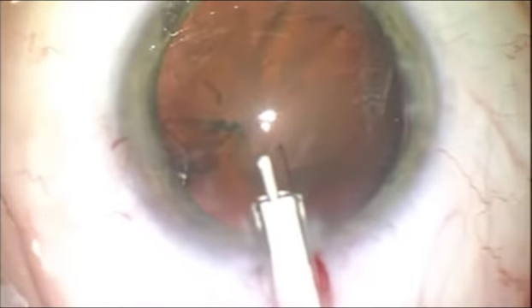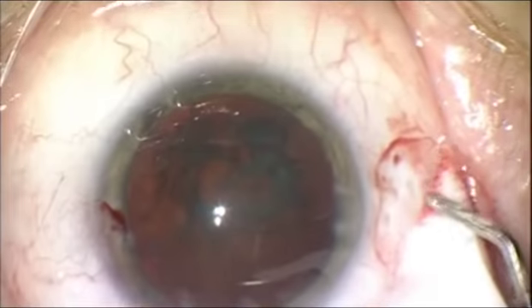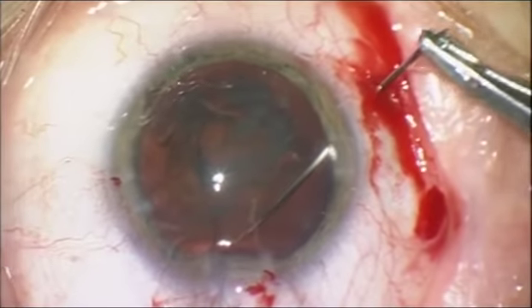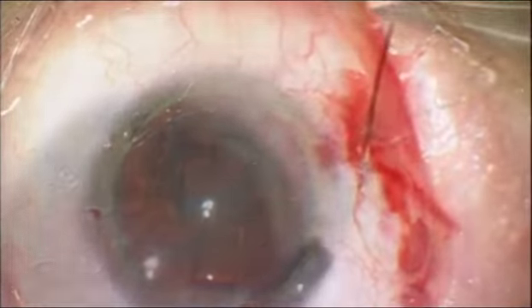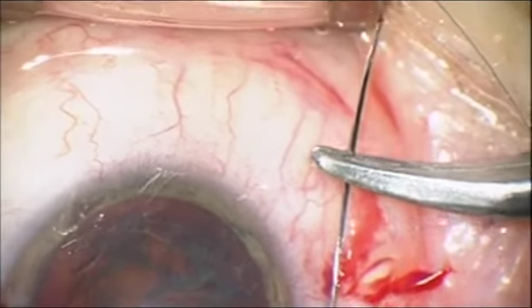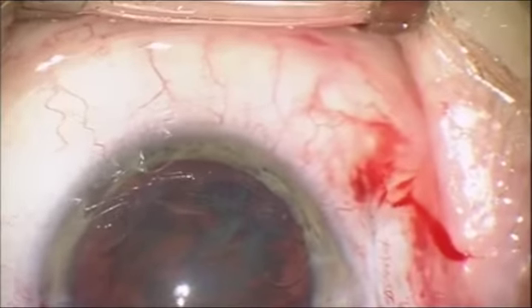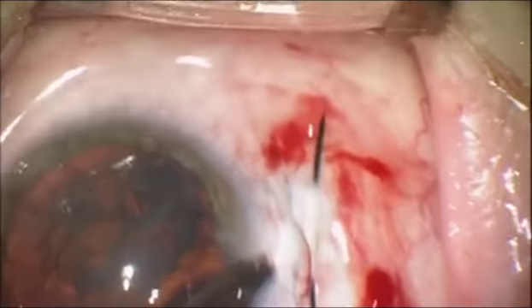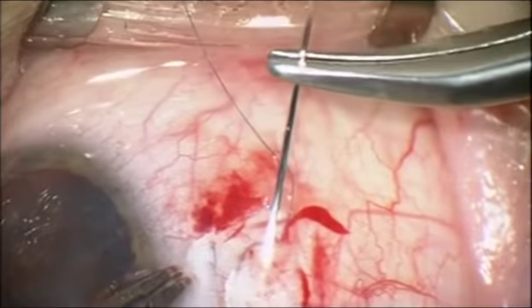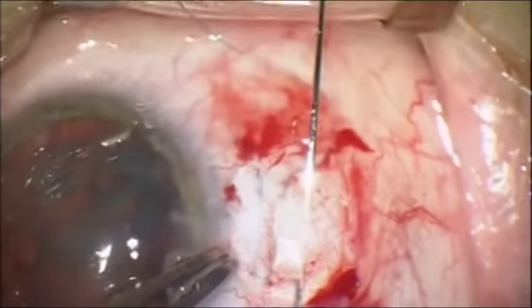CTR is now rotated to place the fixation element in the area of the zonular defect, and the needle is passed through the ciliary sulcus outside of the eye and then fixated to the sclera in the zigzag manner, which does not require any flaps in order to bury the knot of the suture. 4 or 5 bites are usually adequate to achieve good stability and fixation.